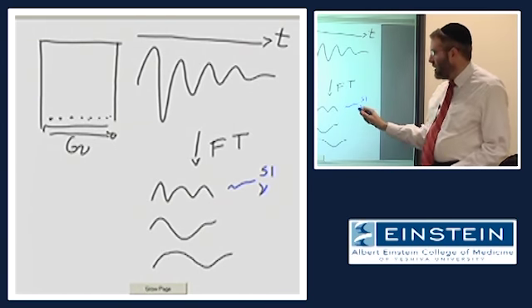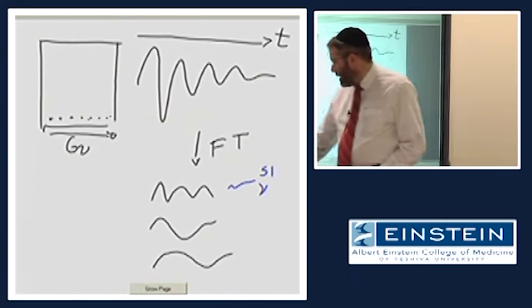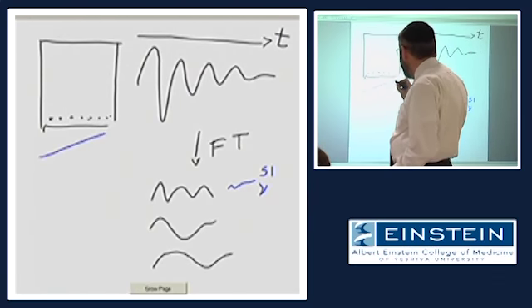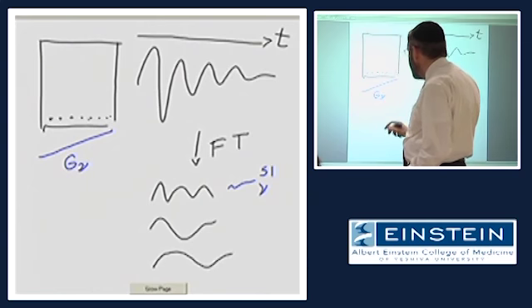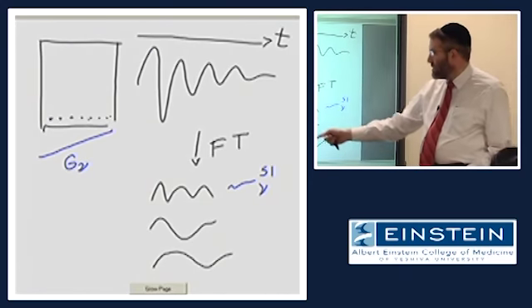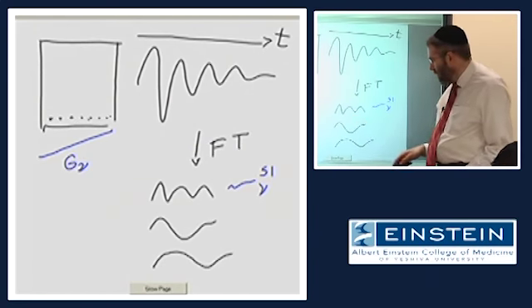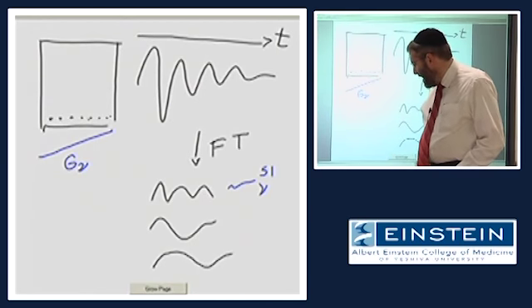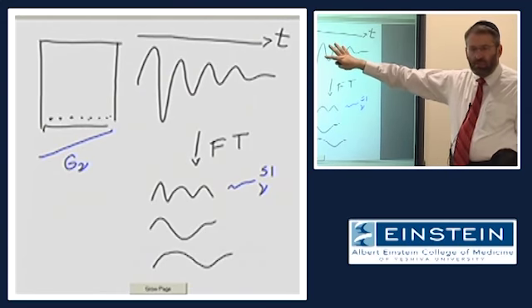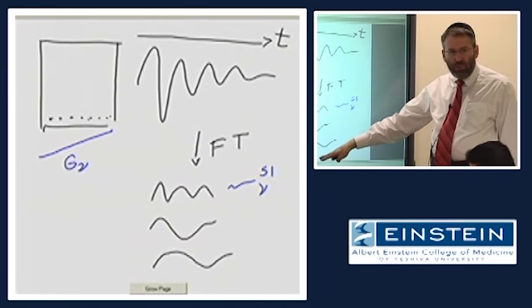Based on the frequency, we know the location left to right in the image, because this gradient magnetic field changes in a linear fashion. So we get a whole bunch of different frequencies, and we know how to line them up left to right in that image. So the issue at hand now is, how do we do this? How do we go from this one single composite signal into all of these different components?